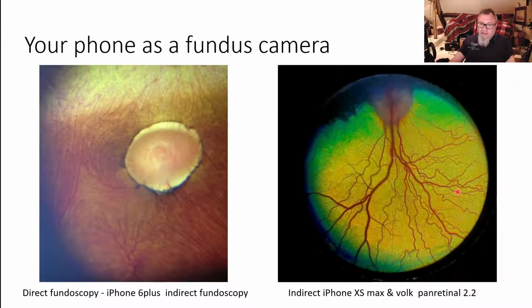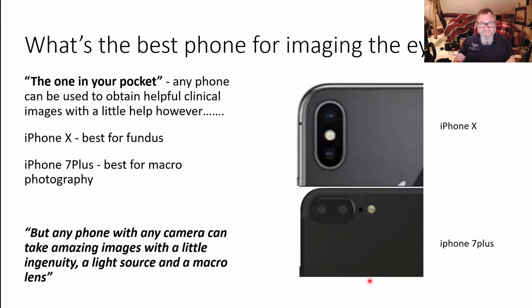This is a dog, and a pan-retinal lens, which we are using to image the fundus here. Both techniques are very helpful in dogs and cats. Using the indirect technique, imaging the projected fundic view from the lens, is often easier, unless you've got a fully dilated pupil and the patient is going to sit still for you.